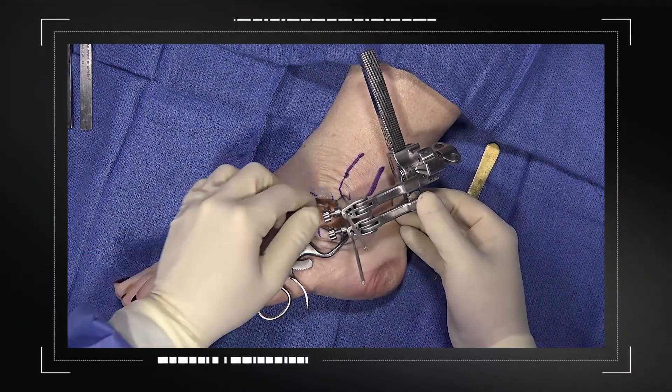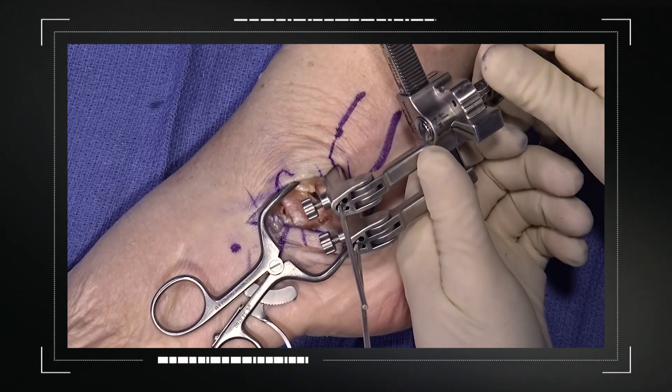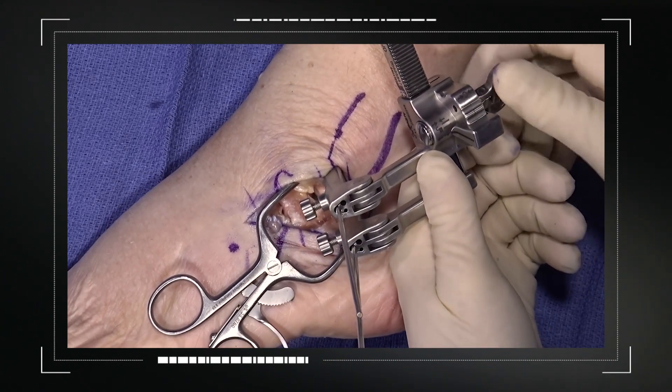Here we see Dr. Schweitzer using the mini joint distractor for a triple arthrodesis in a cadaveric setting. He's able to fully distract the joint to get easy access for joint preparation.